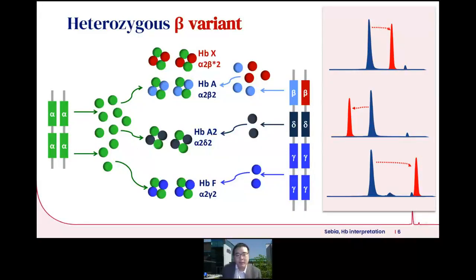So what happens when one of the beta chains is mutated? Remembering that you only have 2 copies of the beta gene. With that mutation, you divide your hemoglobin A into 2 peaks in the capillary electrophoretic profile. However, the shifting of the direction of the peak is dependent on the nature of the mutation, because different mutations will present a different chemical change, leading to shifting of the hemoglobin X, the variant peak, in either direction possible. Right? So you could see on the right all the possibilities of a hemoglobin beta variant.